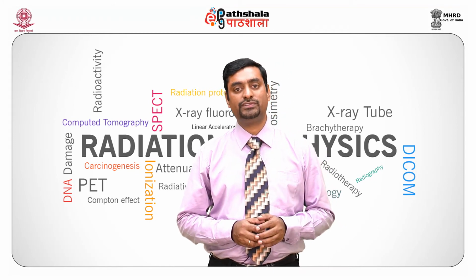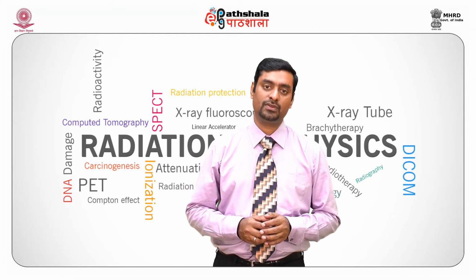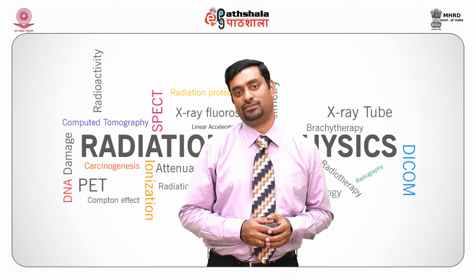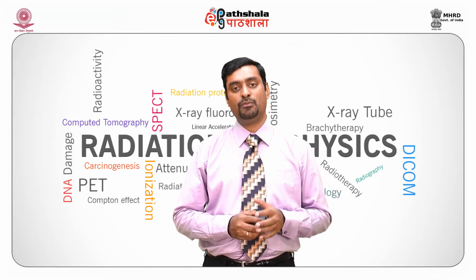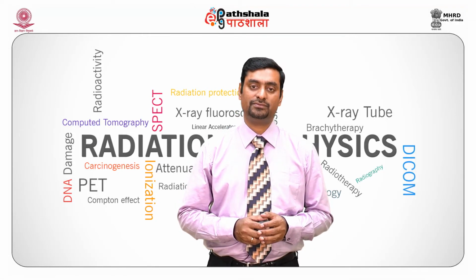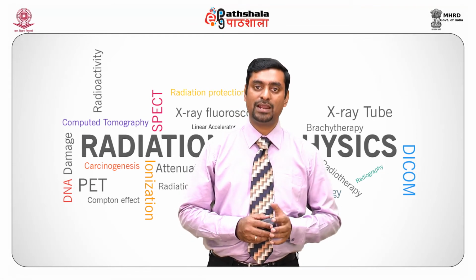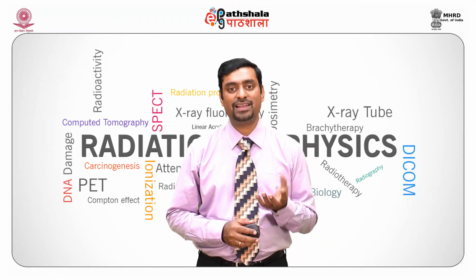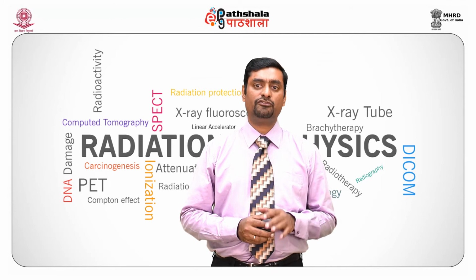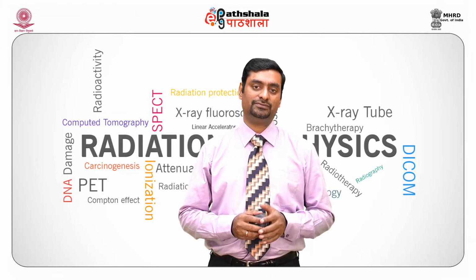Next, we move on to direct flat panel detector. All this while we were seeing how the indirect method works. May it be a film screen combination or a CCD based device or an indirect flat panel detector, they use light to form an image, except in some cases where films can be used directly.